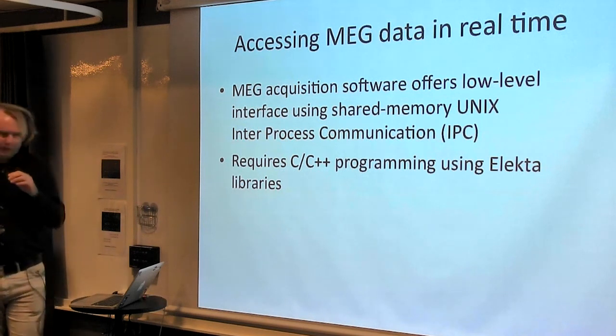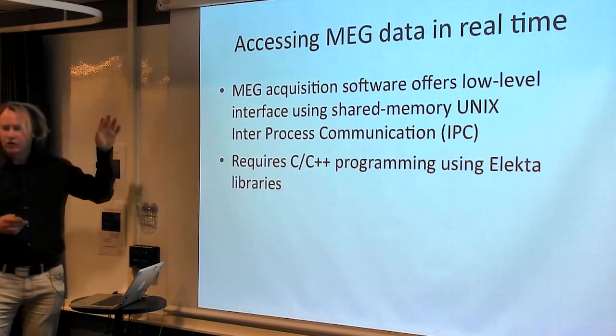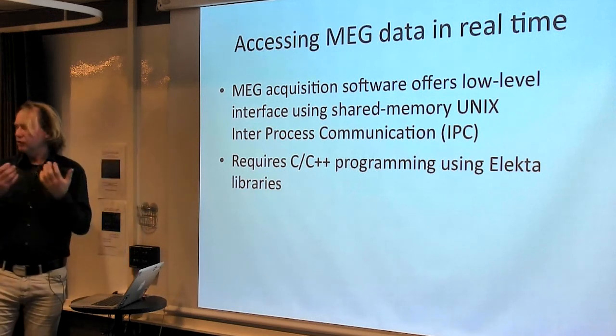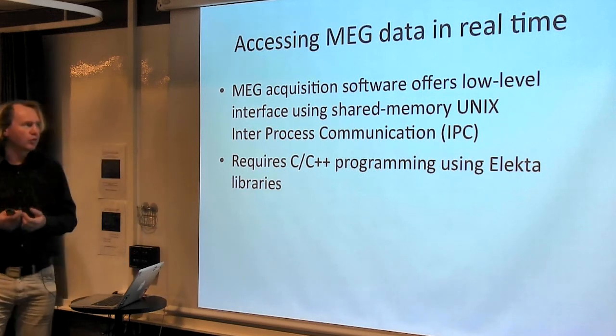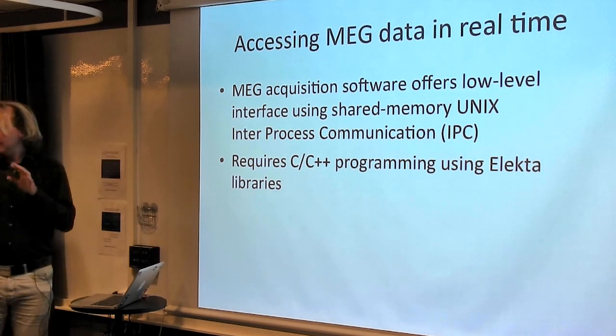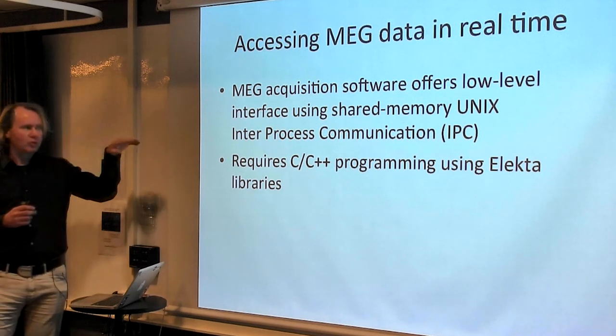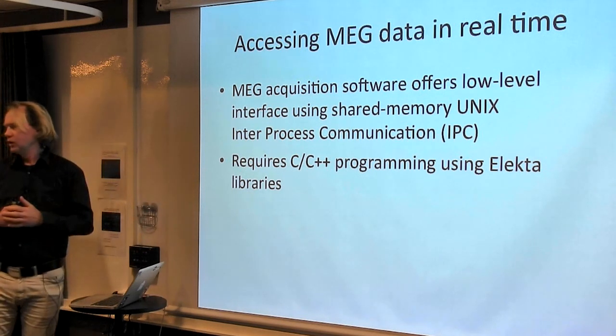Okay, accessing MEG data in real time. MEG acquisition software, or in general, electrophysiological data acquisition software, usually offers a low-level interface. The Elekta software offers a low-level interface using shared memory, Unix-specific inter-process communication.